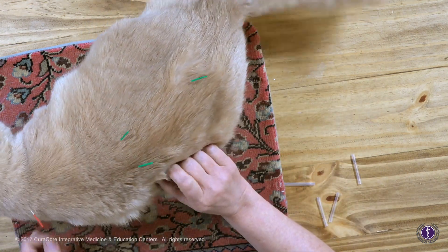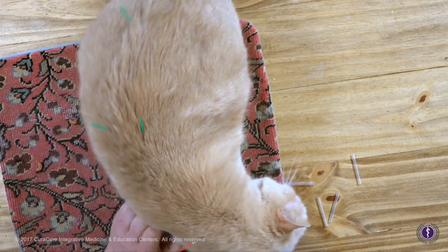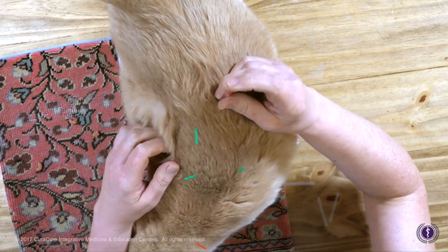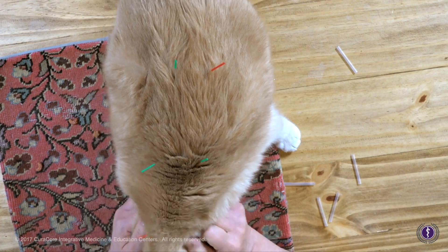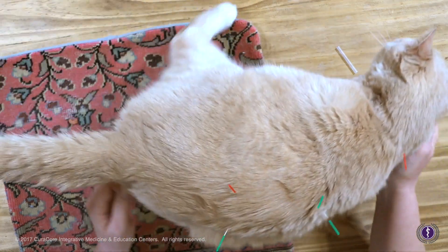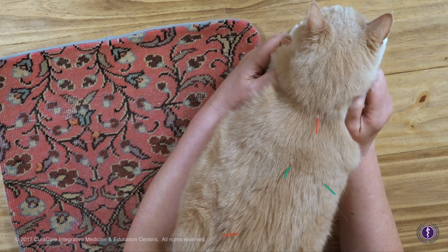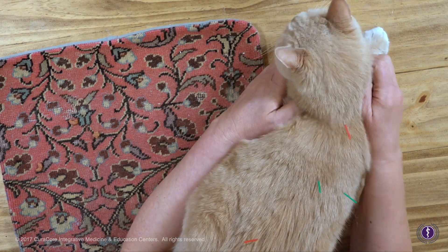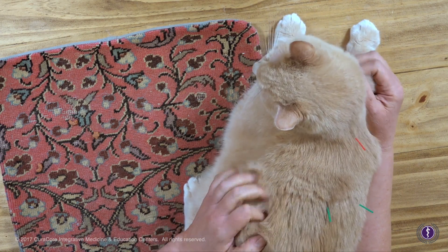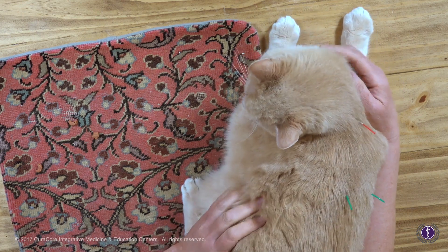Everything's still good, kitty's purring. If we were treating points on the limbs where he could lick it, we wouldn't like that much, so you'd usually want to have help. I'm showing how these are more safe points. My goal with this needling is just to show we use thin needles, we don't aggravate the kitty, and we can use some massage — and nobody's the worse for wear.